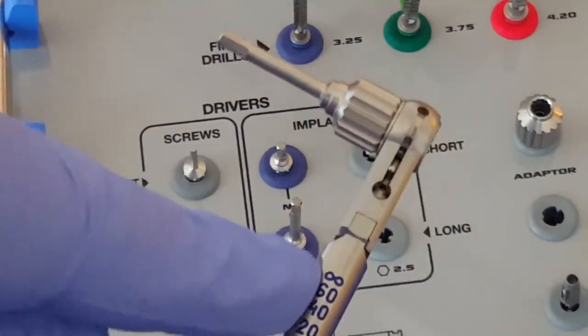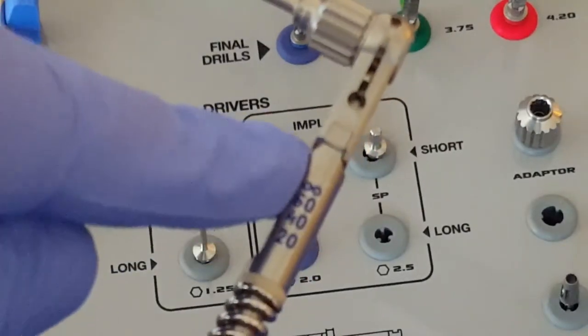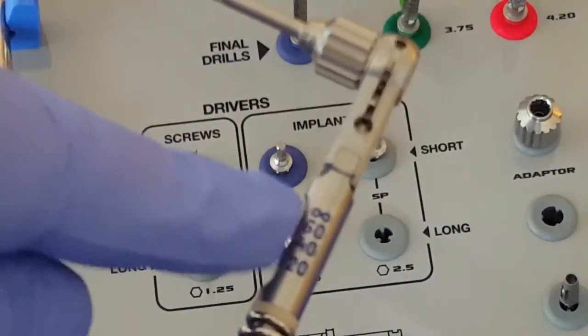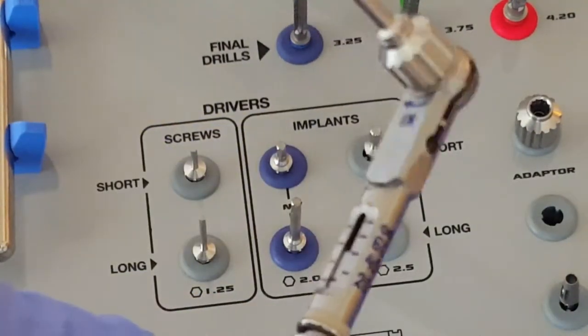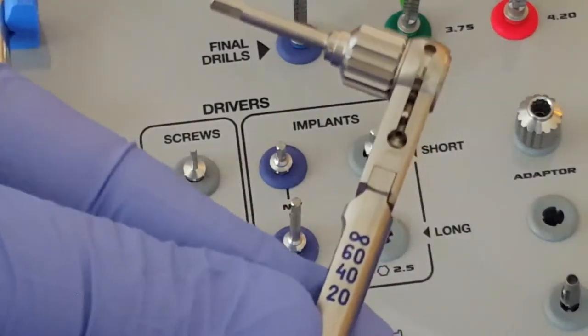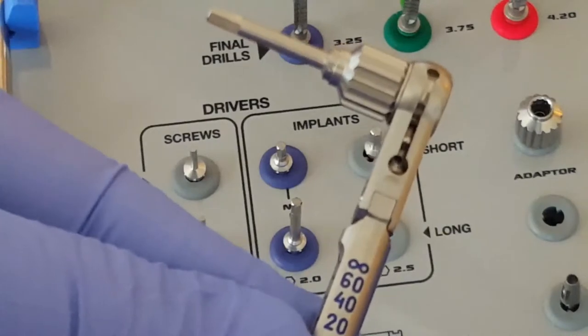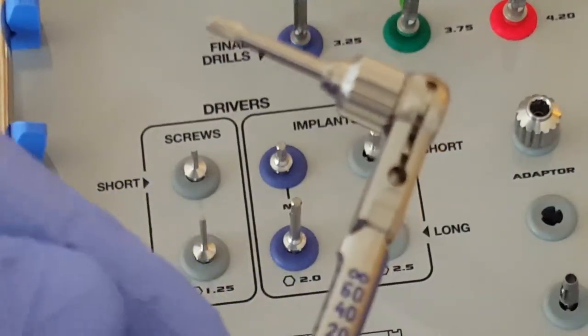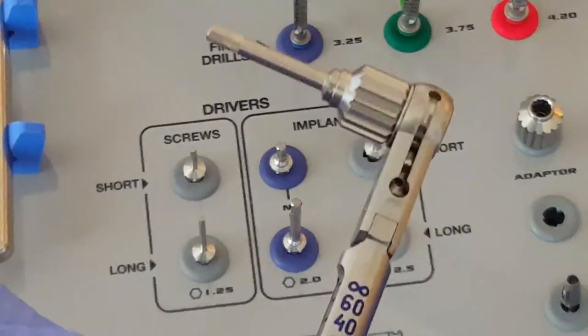Now we can utilize these numbers, 20, 40, 60 Newton centimeter, to go ahead and set the appropriate insertion torque. For the Paltop implants, we generally recommend not to exceed between 30 and 40 Newton centimeter.